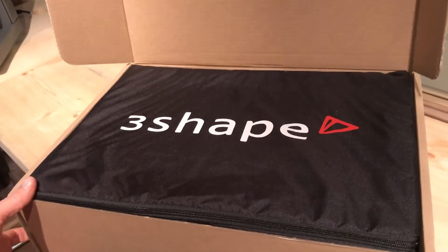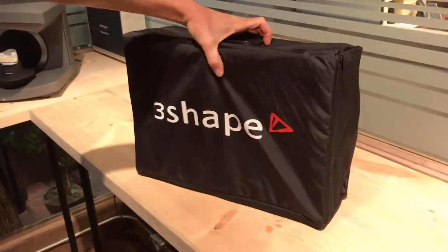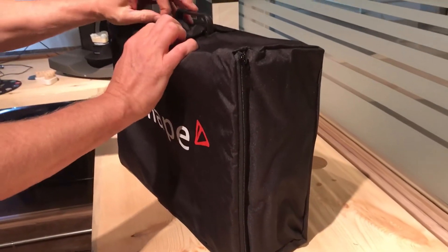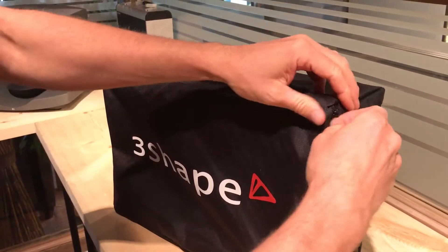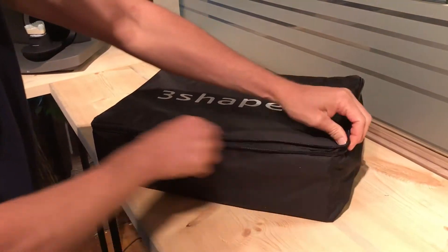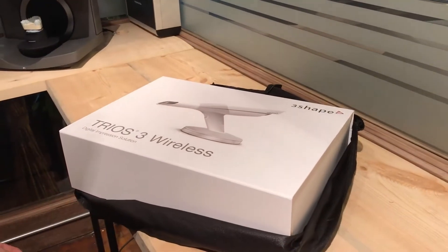As you can see, it comes in a carrying case. I'm just going to pull this out. So this is a reusable carrying case. If the device needs to be moved from practice to practice, it can quickly be broken down, put back in the carrying case, and then moves to a different practice. And there we go — Trios 3 wireless.